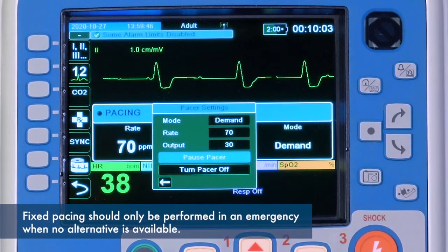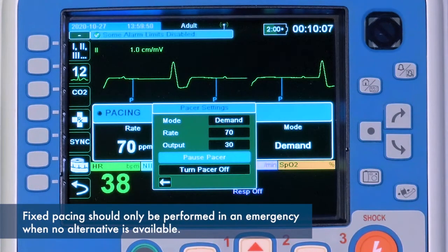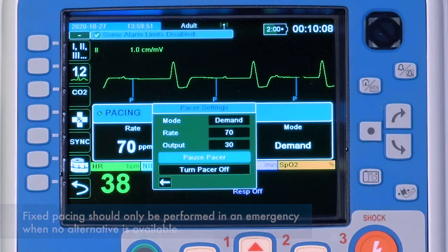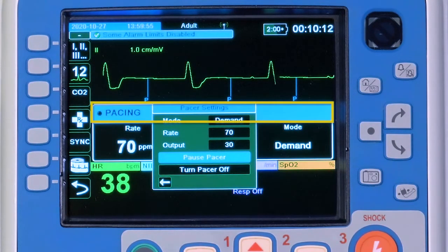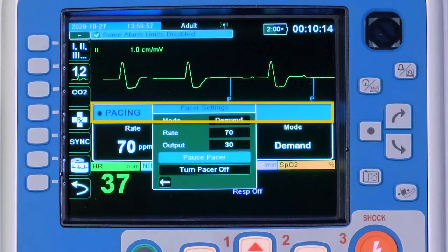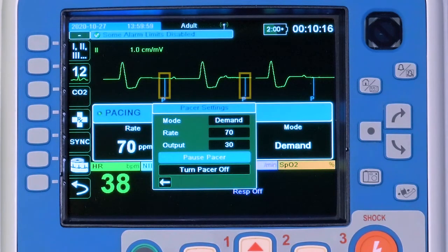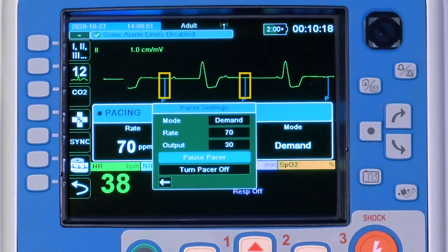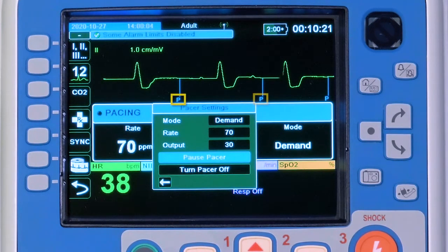Fixed pacing should only be performed in an emergency when no alternative is available. When the X-series Advanced Pacer is active, a blue bar will appear at the top of the Pacer window and blue Pacer markers will appear in the ECG. The letter P will appear under each Pacer spike.